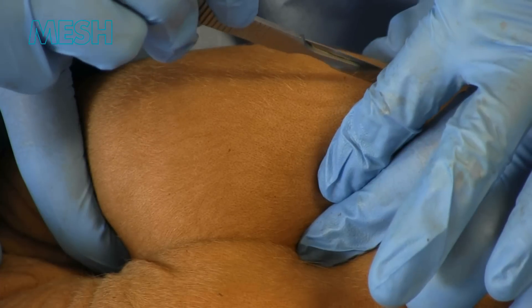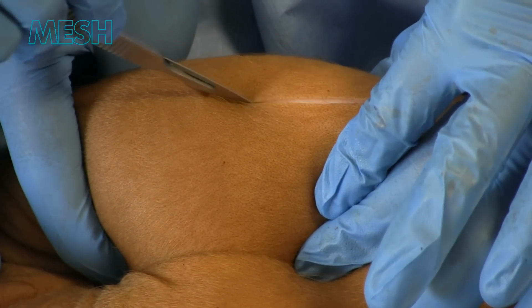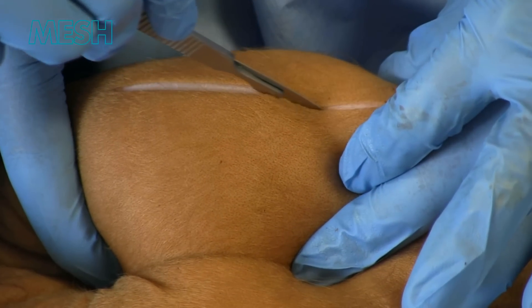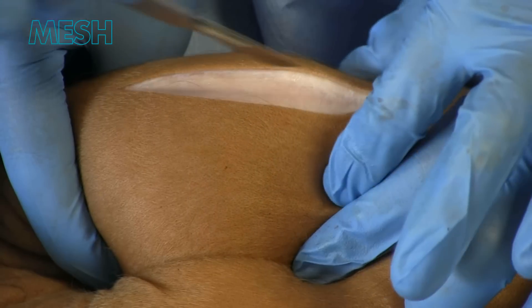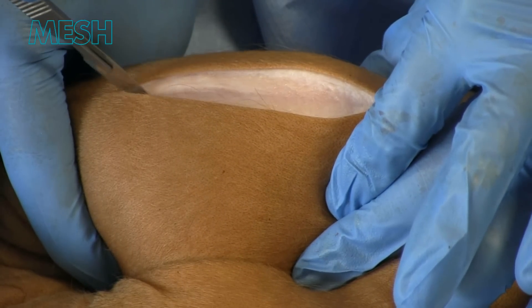This shows routine prep and drape followed by a vertical incision overlying the right hemiscrotum. This is performed through skin and subcutaneous tissue. In real life, there would be bipolar diathermy available for small vessels.